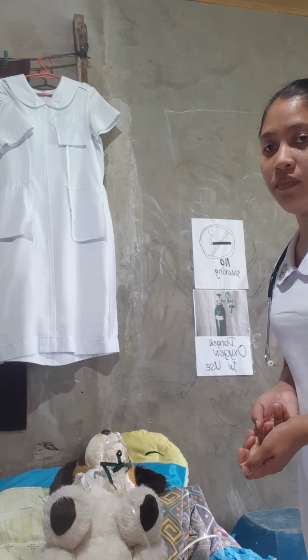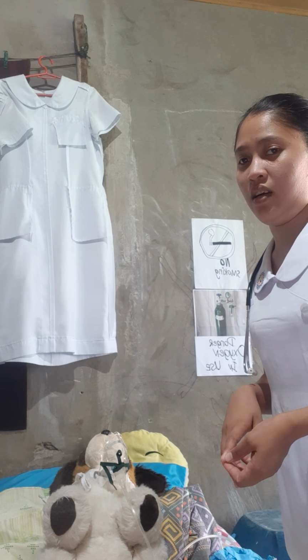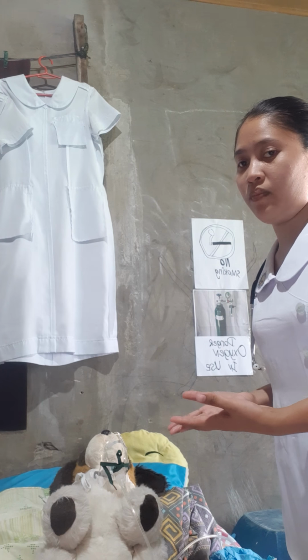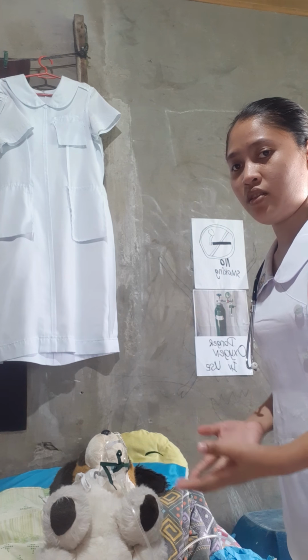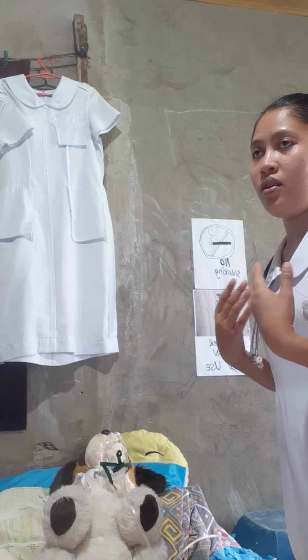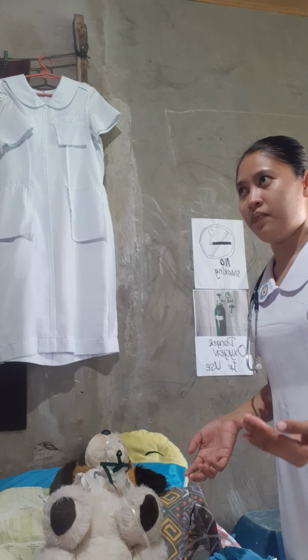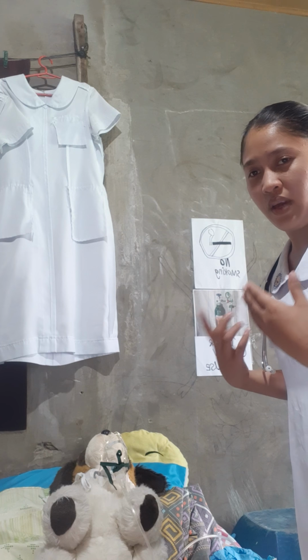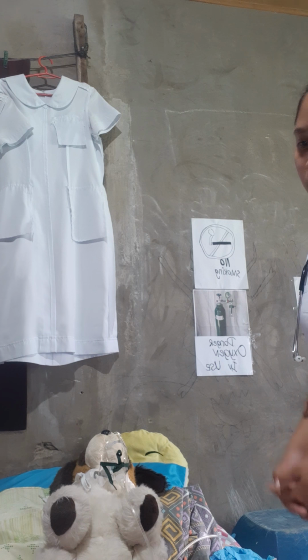We need to explain to him even if he does not look alert. Also, we need to reassure him that in the process of the procedure, he can always interrupt me if he feels or experiences respiratory difficulties, like he cannot breathe, or if he feels pain. So afterwards, perform hand hygiene.